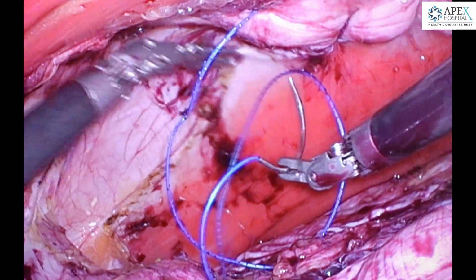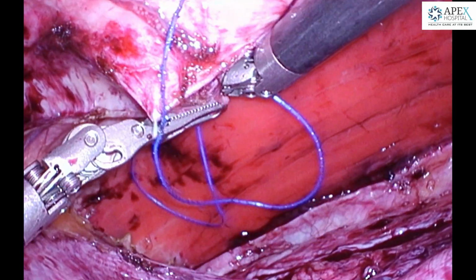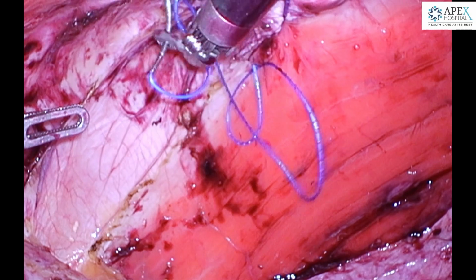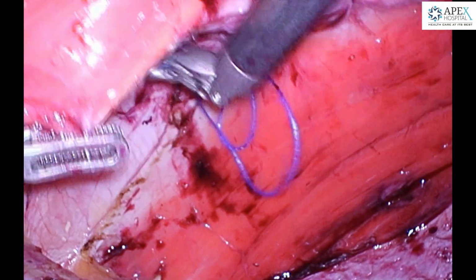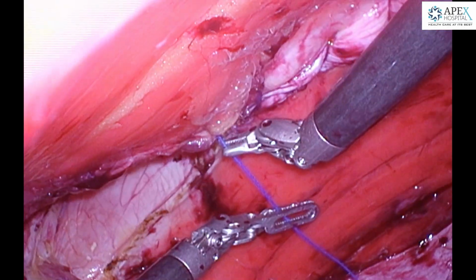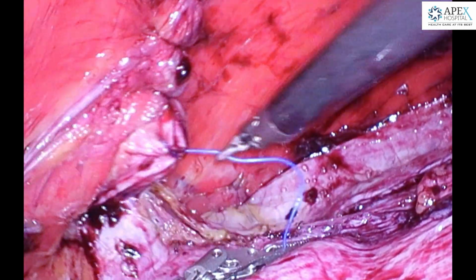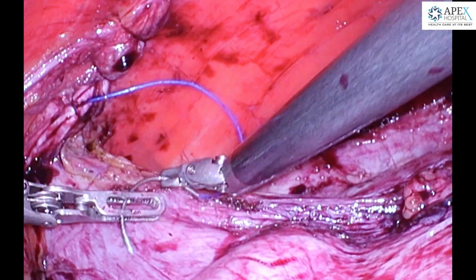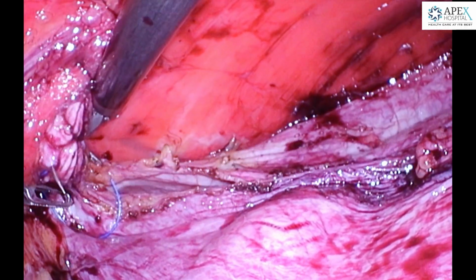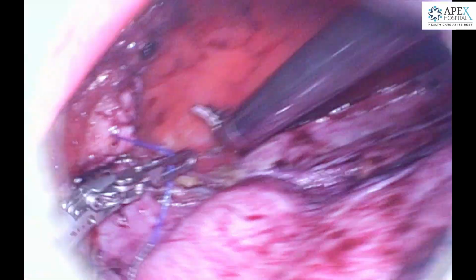This suturing in the upper part of the linea alba is the biggest advantage of the wristed instruments in robotic surgery. The suturing is now being continued downwards in the caudal direction to completely suture the linea alba, which is divaricated. Here we can see that there has been complete apposition and the entire linea alba has been reinforced.